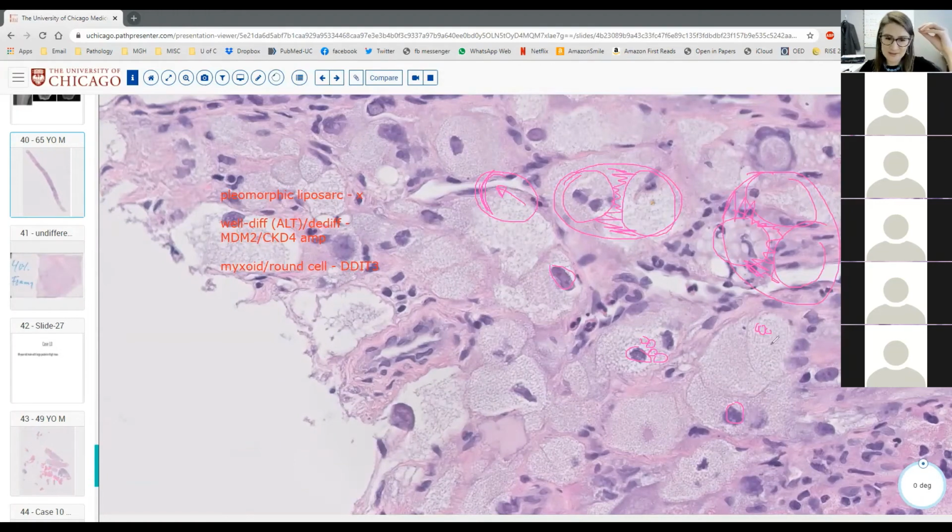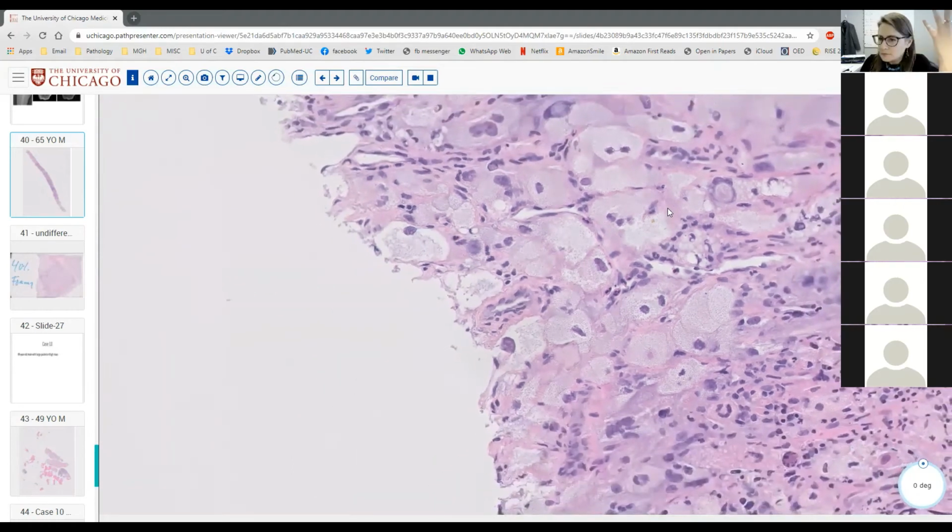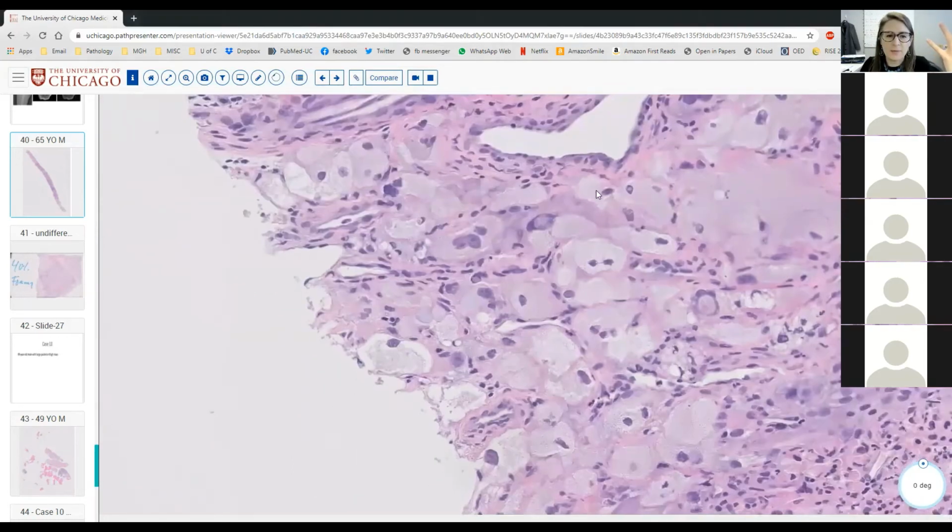So that's the same concept that we see here. We see small vacuoles with the nuclei being plump and not compressed. And so nuclei being plump and not compressed, to me, does not indicate a true lipoblast. But that is certainly what you have to consider.